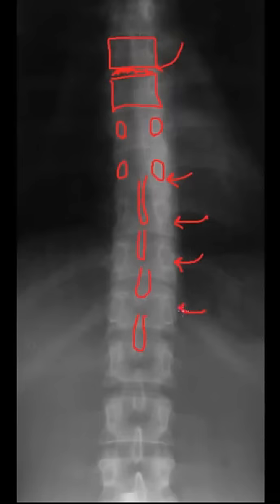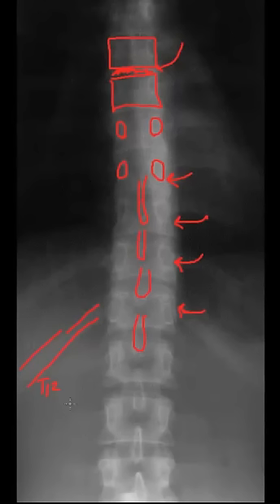Now how did I know this is T12? Well, if you notice on the periphery, just lateral to the vertebral bodies, you'll notice this last rib. Typically the last rib is going to be the T12 rib, or the 12th rib. However, similar to the cervical spine, you can have lumbar ribs, which is anomalous — typically they'll be hypoplastic. Nonetheless, this can confuse your counting. A more accurate way to count would be to start from the top, identify T1 with their upward-pointing transverse processes and count from there, or start with the first rib given that it's extending off the T1 segment. This is much more accurate for counting.